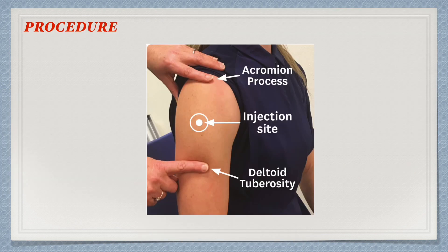Let's see the procedure. After checking the physician's order, arrange necessary articles and go to the patient's side. Explain the procedure to the patient and position the patient according to the site of injection. Here it is the deltoid site, so make the patient sit with elbows slightly flexed. Then inspect the area of injection and clean the area with antiseptic liquid. After that, hold the syringe between the thumb and forefinger in a pen-holding manner.